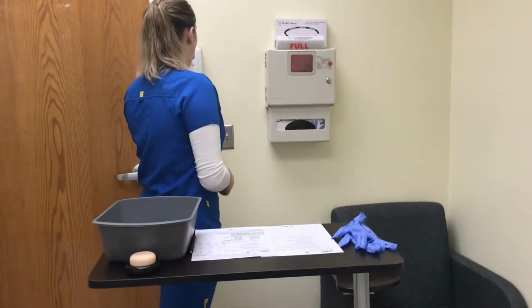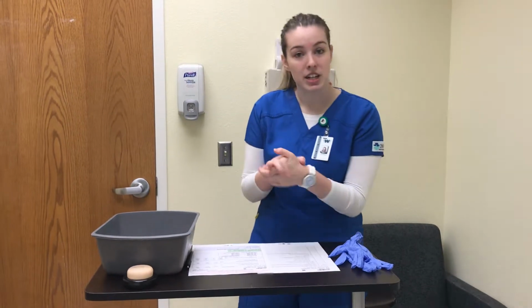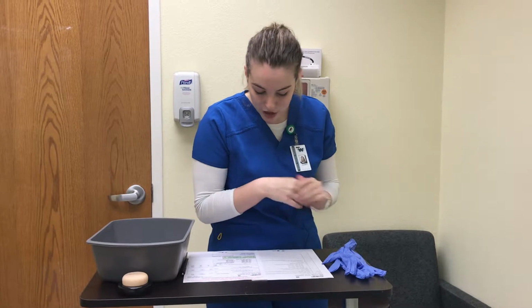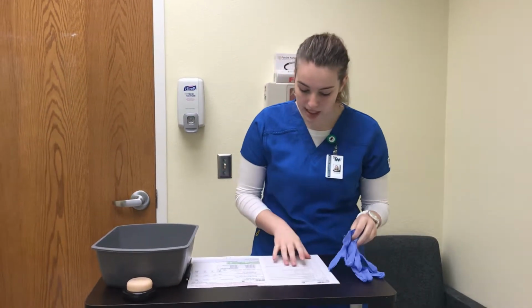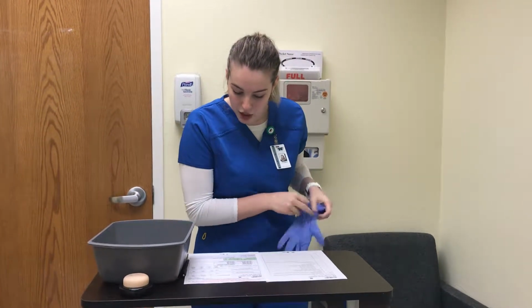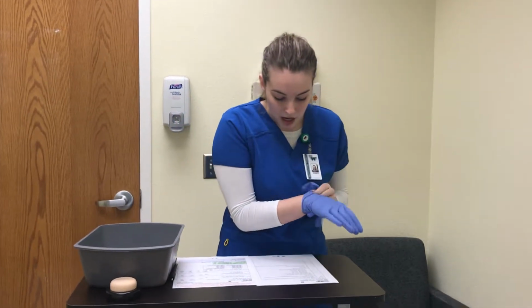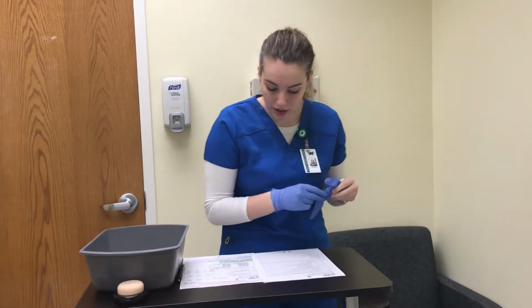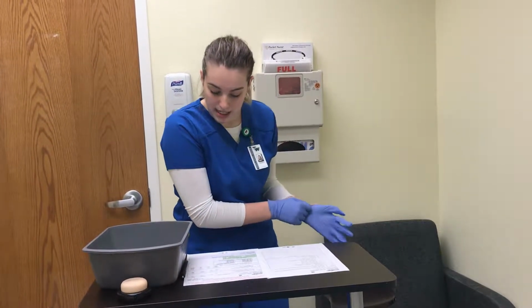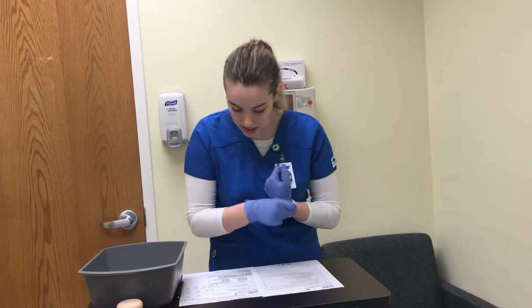So while I compare my healthcare provider's orders to my MAR, I'm just going to do my hand hygiene and don gloves at the same time. So first I have my demo dose NPH insulin U100, 15 units sub-Q daily with supper. I have my demo dose regular insulin U100, 10 units sub-Q, and that is BID.